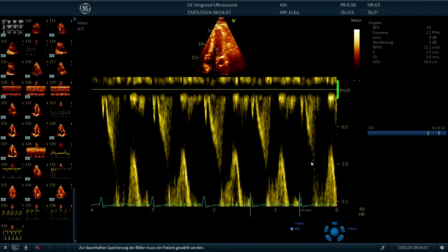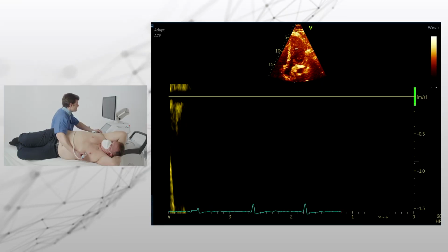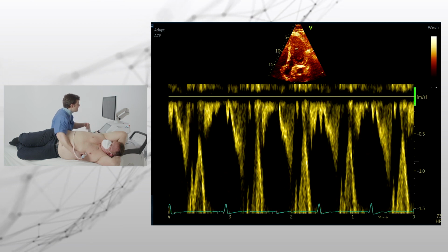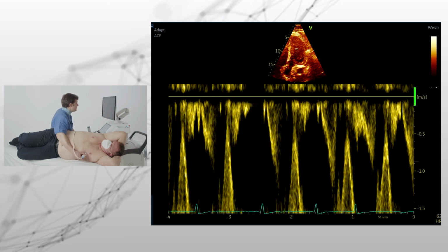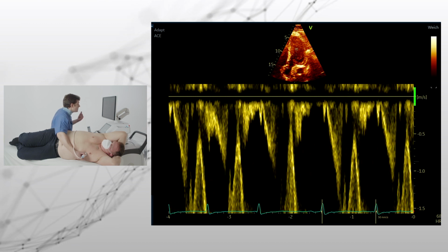And like this, we can move more inwards the ventricle. Let me reduce the sound a little bit, but we still want to hear and see what the signal is like. And here, with the atrial fibrillation, there was a slower AFib present briefly. And here we also see there is sort of a gradient, but it's also not that high.